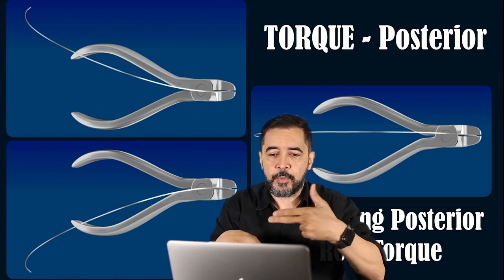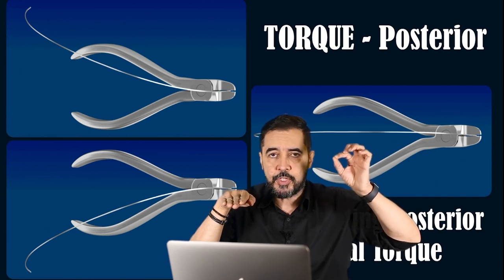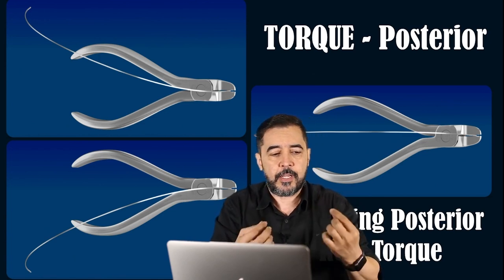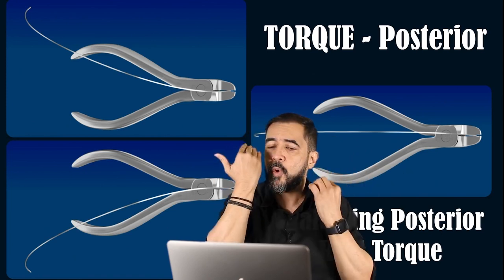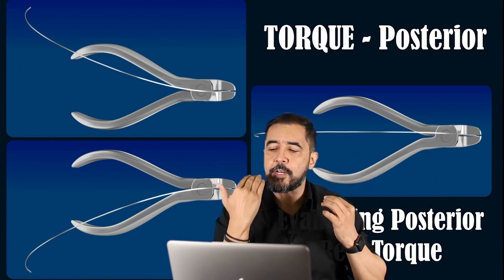Just think of it. Grab the arch wire in the posterior segment and think, when I'm going to a horizontal position of the arch wire, meaning I'm going to the level of the tube in which it will be inserted in a clinical situation, it goes to the tube, so we have this, okay? So I put it here in the posterior part of the upper arch wire.